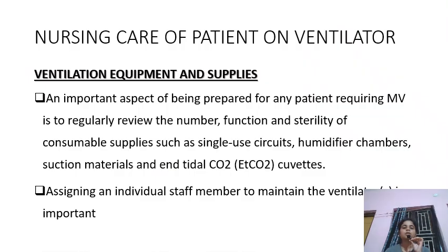Now coming to the nursing care of patient on ventilator. So we have seen superficially about the ventilator, the modes, the normal physiology of respiration, the types of ventilators. Okay, so now we will see the nursing care of patient on ventilator.